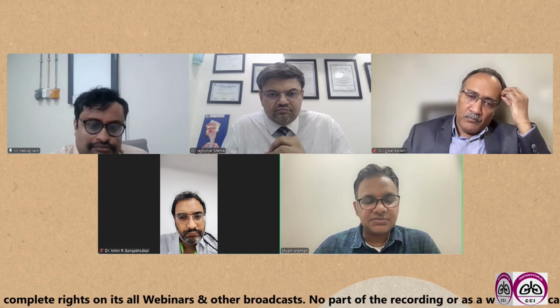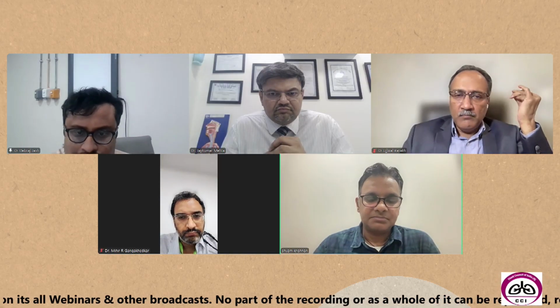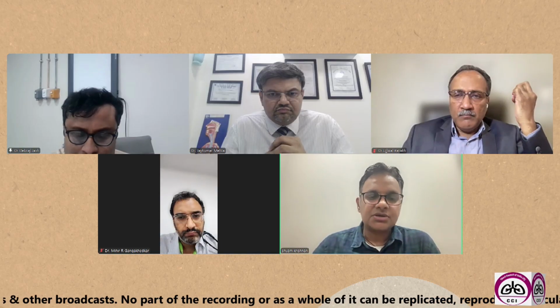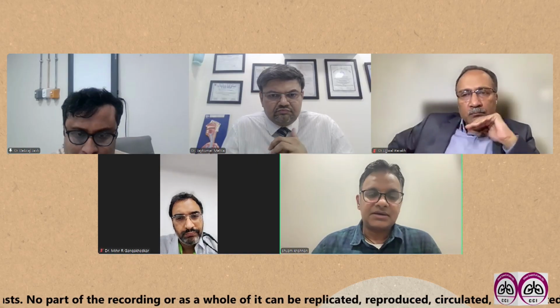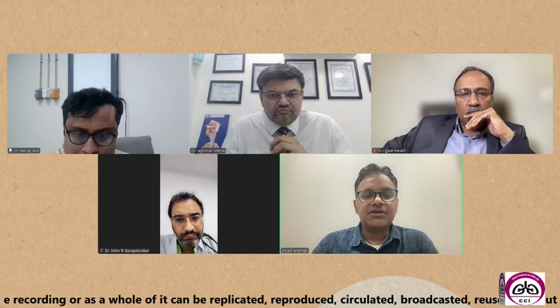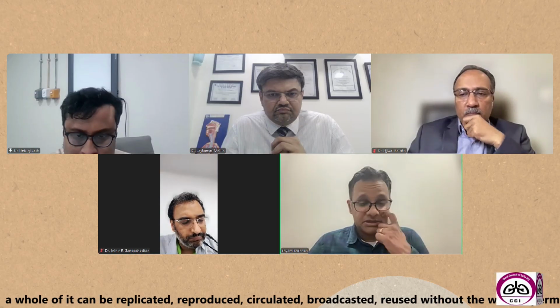But the first prerequisite I keep is knowing bronchoscopy very well. They should be very good at the usual white light bronchoscopy, having done at least 50 to 60 bronchoscopies independently, after which I give them a chance to come to the EBUS procedures.